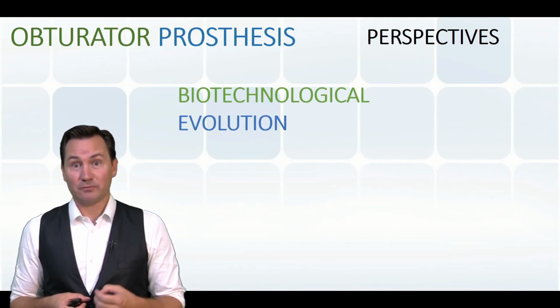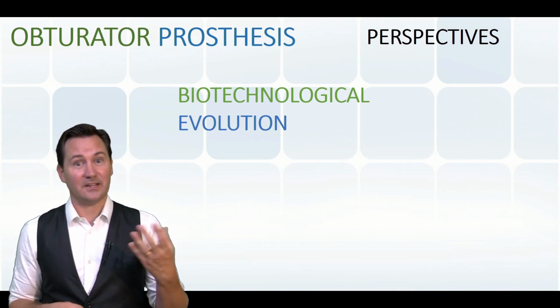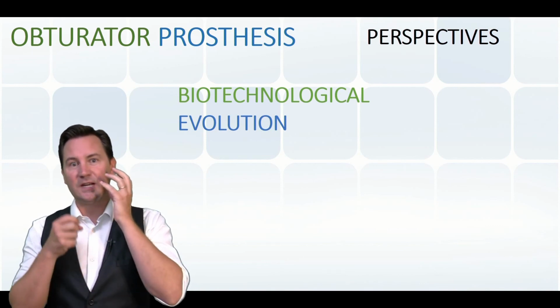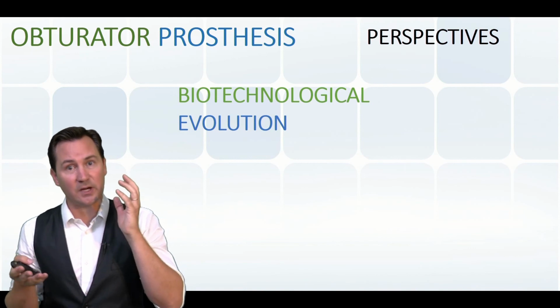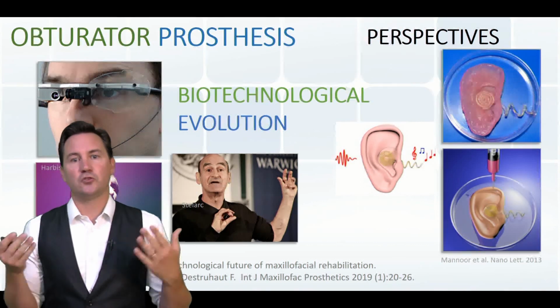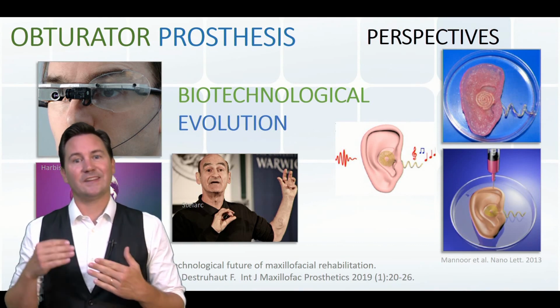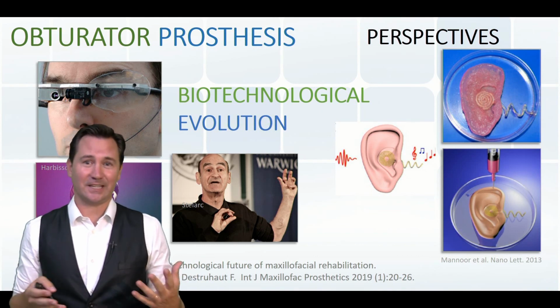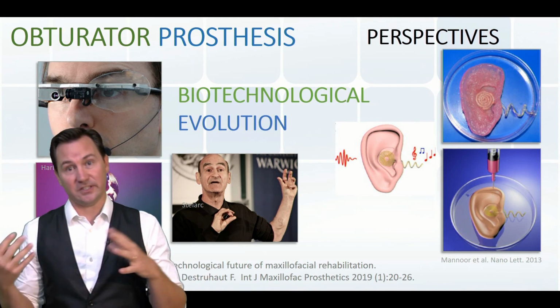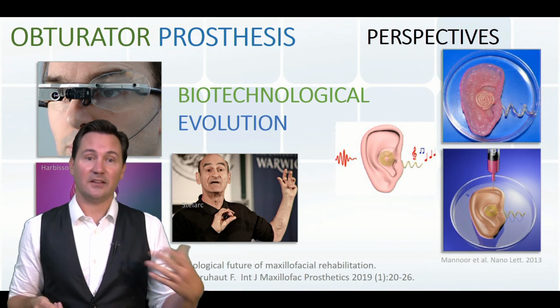And some biotechnological perspectives are still expected and could be developed for maxillary defects. One can imagine one day an obturator releasing synthetic saliva, for example, or drugs. But beyond the future repaired patients stand the improved patients, the transhuman with additional biotechnological functions, in a perfect symbiosis of surgery and prosthesis, marrying tissues and frameworks, cells and scaffolds.